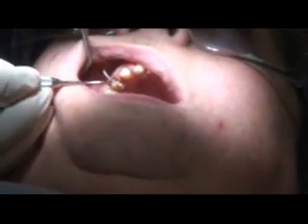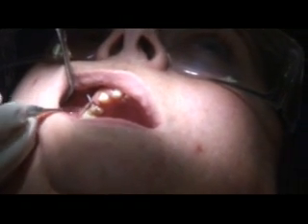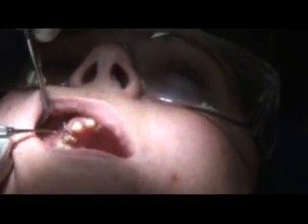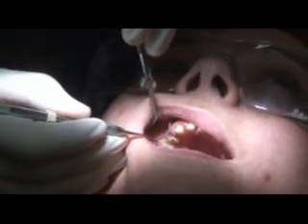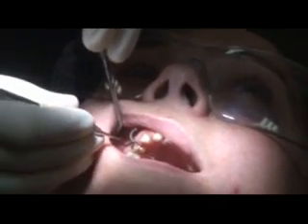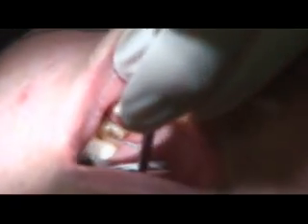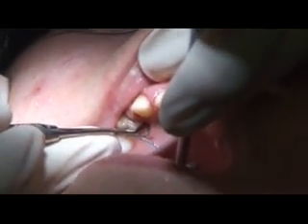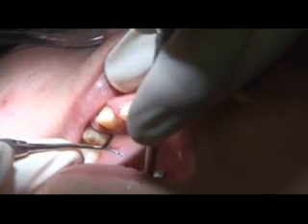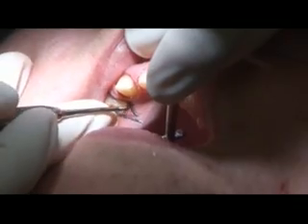Next, we're going to take a small 00 cord and just gently place it in between. When I say gently, I mean gently and firmly. So I'm putting pressure, and I go all the way around the tooth, bit by bit. It's a nice firm pressure where you hold it and stop. Don't do any of this pecking, it won't get you anywhere. Our small cord we want to take all the way around the tooth, subgingival. We want to go below our margin. The small cord has one purpose, and that is to go below the margin and to control the bleeding.